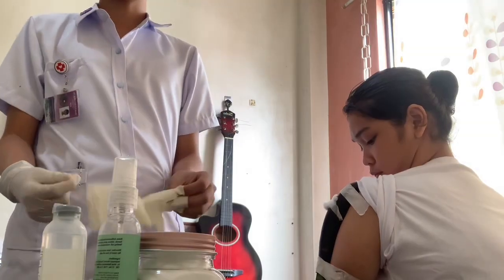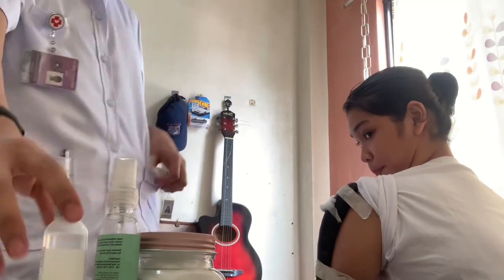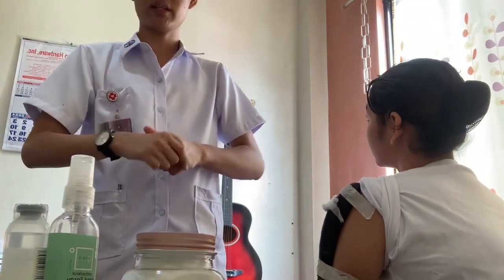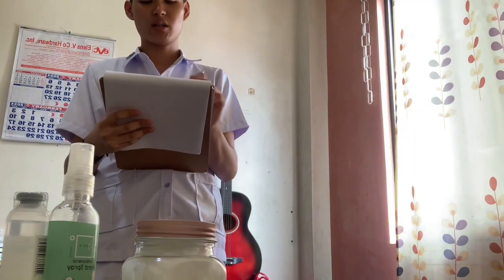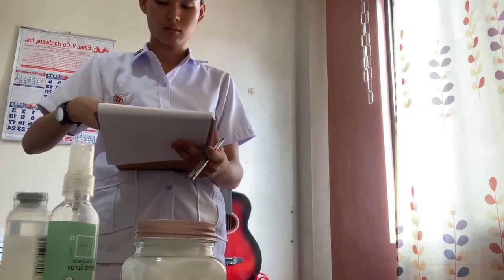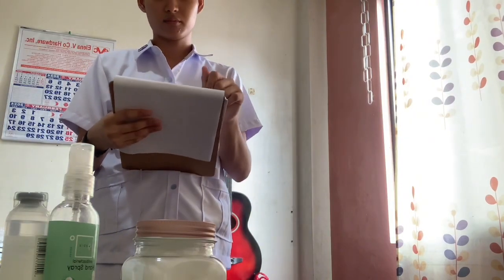Discard the used gloves. Perform the aftercare. And then, what I'm going to do next is to document the relevant information, the time of administration, any complaints or assessment of the client, and assess the effectiveness.